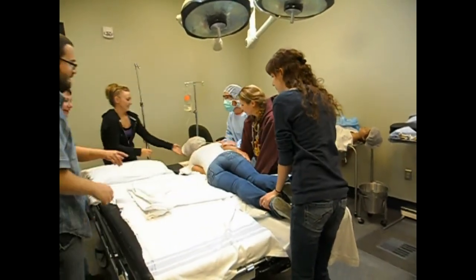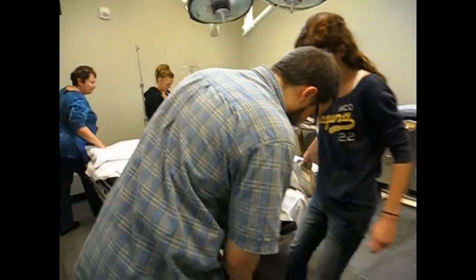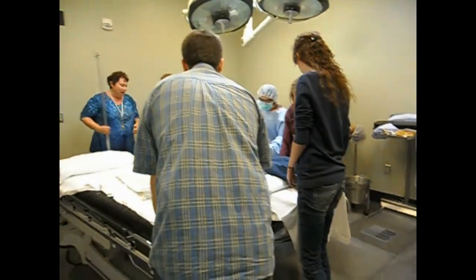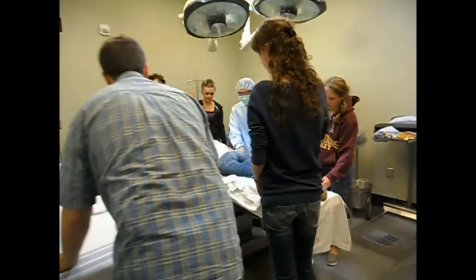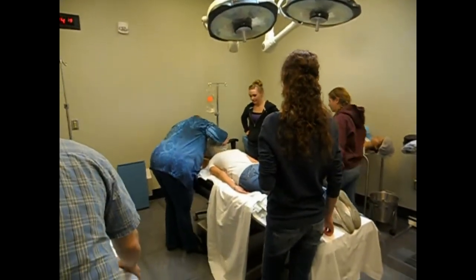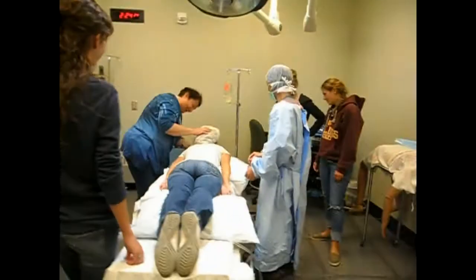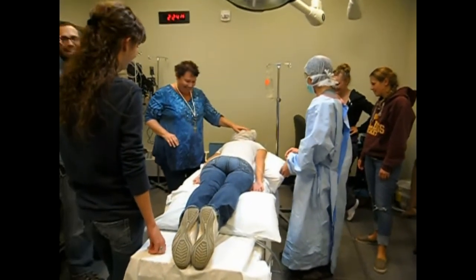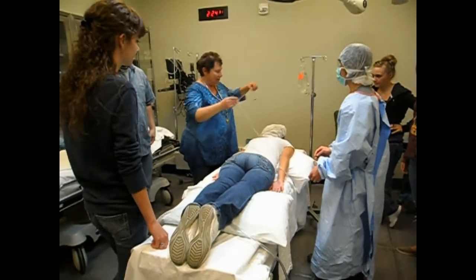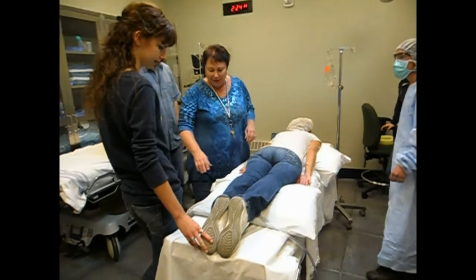Okay, now we've got to get this bed out right away. Unlock it. There you go. Now, and we don't have any cords caught on anything, do we? No. Okay, so the very first thing we want to worry about at this point is that she is reconnected to the endotracheal tube. How is your head? Okay? Not comfy. Oh. Okay, and see this IV now, it's kind of wrapped around. So we're going to get it over on this side. And we've got the pillow here.